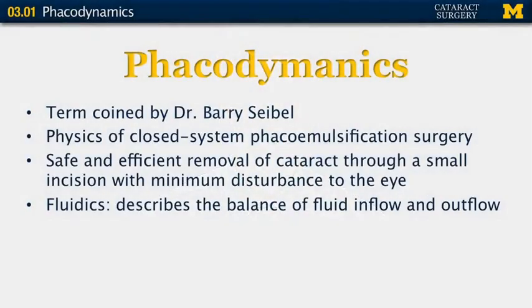The term phacodynamics was first coined by Dr. Barry Seibel more than 10 years ago, and he used the term to describe the physics of closed-system phacoemulsification cataract surgery and how it translates into clinical performance. In other words, it's the safe and efficient removal of a cataract through a small incision with minimal disturbance to the eye.